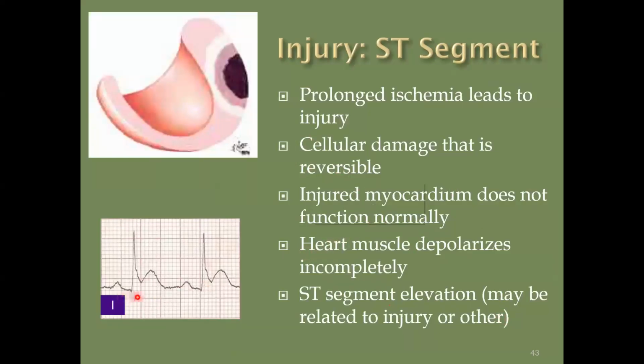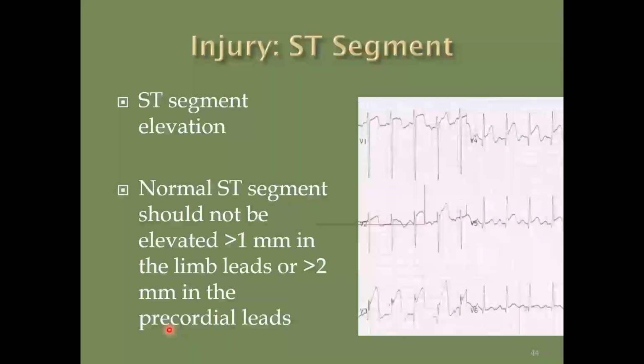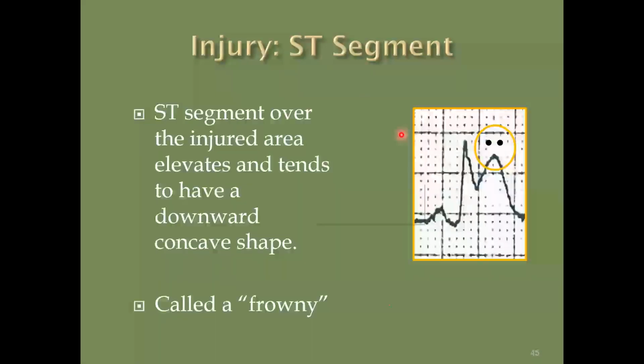And if you look over here, here's your ST segment, and it's way up here. It's kind of merging with that T wave. And I'm going to talk a little bit more about that soon. But if you look here, again, here's your ST segment elevation above the baseline. ST segment elevation above the baseline. And that would be indicative of injury. And if we don't restore blood flow, this patient's going to have dead meat from the infarction.